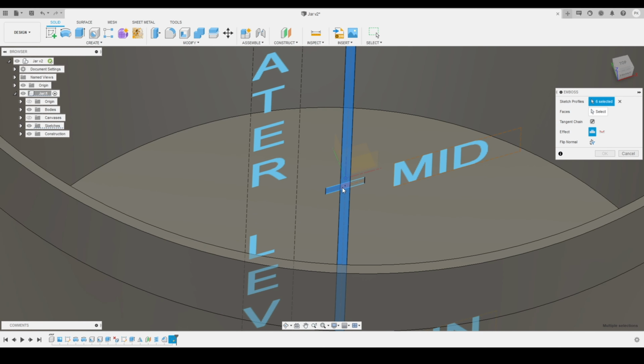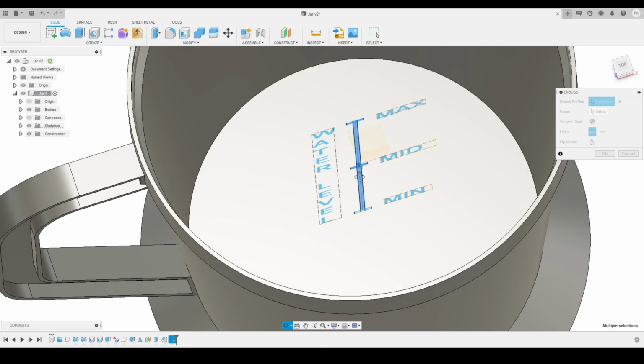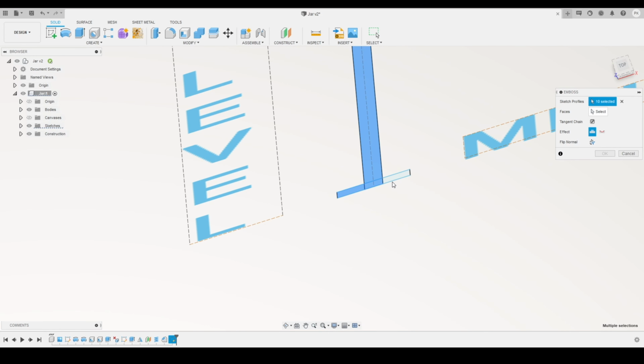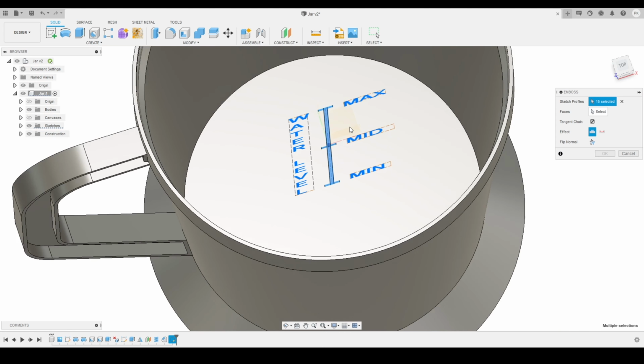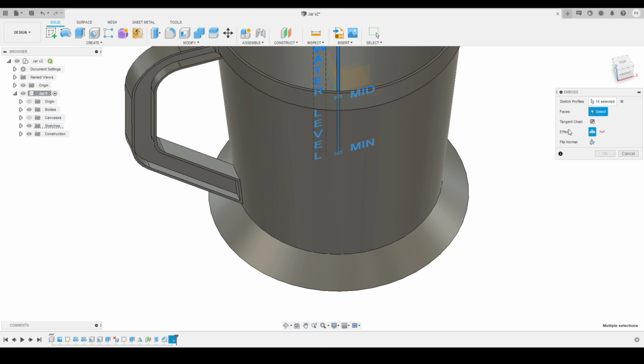So carefully I had to select all the profiles, so I don't miss any of them. Here you can see I had selected, then I will select these text profiles as well, because these are the major profiles that we want to emboss, and then I have to come over here and select the face on which I want to emboss. So it will give me a preview of the emboss feature.